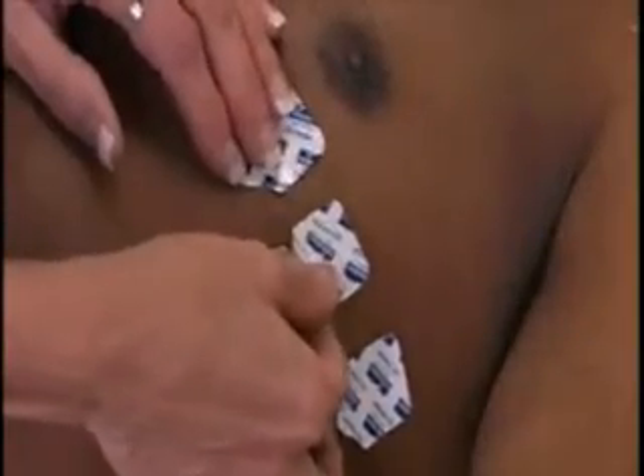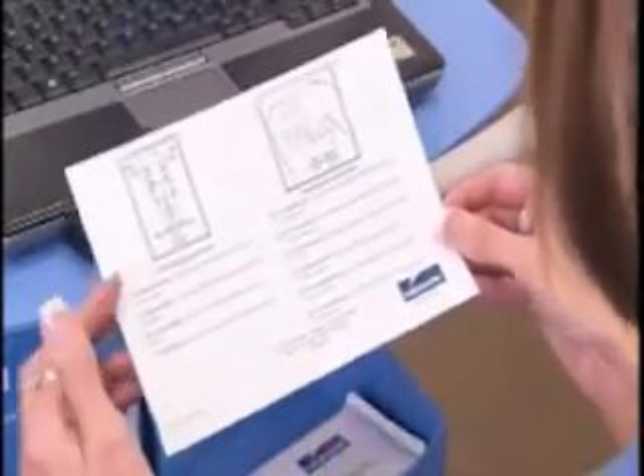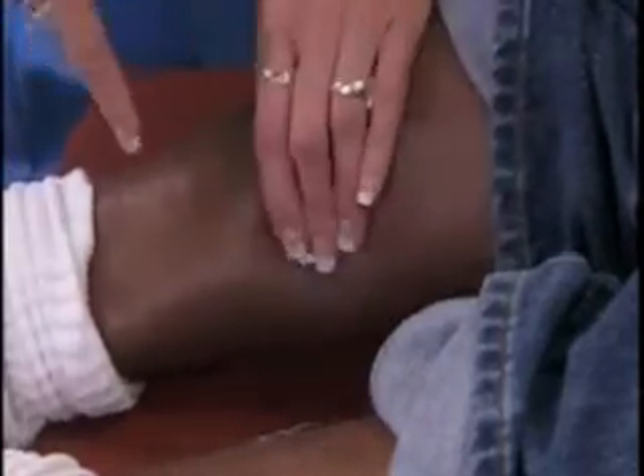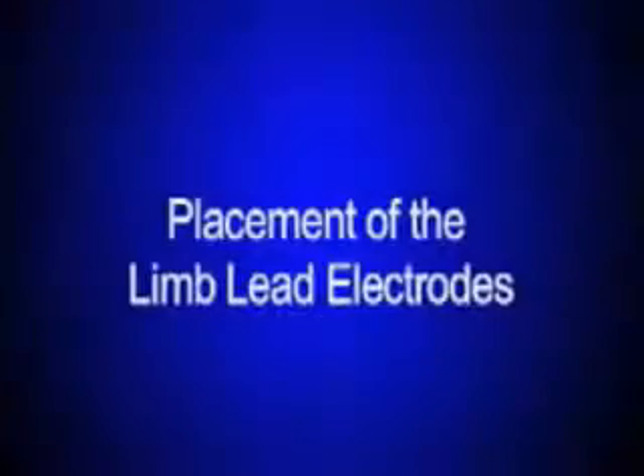Another vital component for an accurate ECG reading is the proper placement of the electrodes. Refer to the quick reference guide for assistance with lead placement. Any deviation from the proper placement, for example due to a physical deformity, must be noted. You are now ready to place the limb lead electrodes.